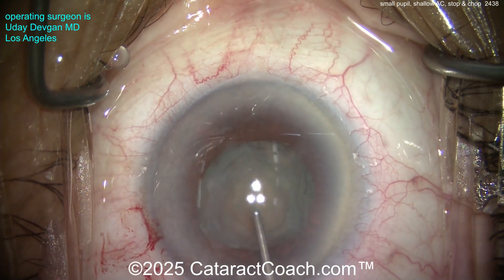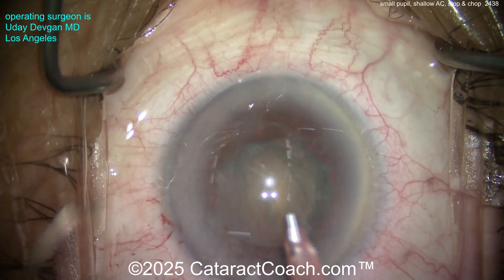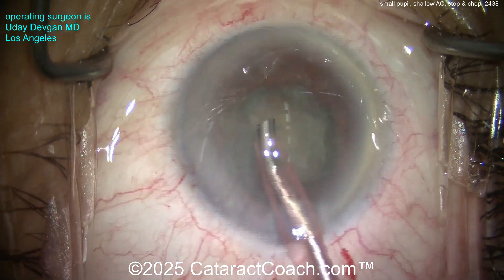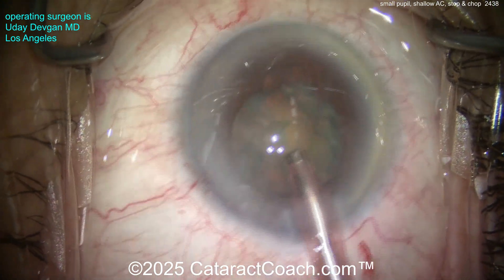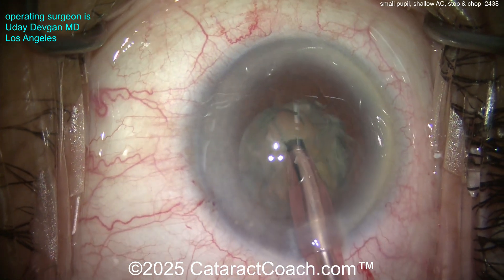Now we can do some phaco — in this case, stop and chop. Why? If I just chop it in half right now, each half would be about 50% of the total lens volume. But if I make a nice wide groove down the middle and debulk the central dense part of the nucleus, then when I split it in half, each half is maybe 45 or even 40%. So I'm going to do a stop and chop.